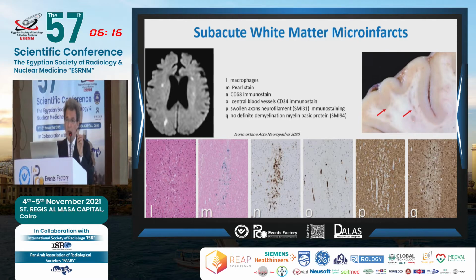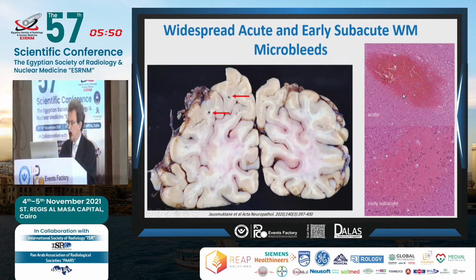Now, you have to be very careful when applying pathological nomenclature to imaging. Quite often you see the term microinfarct being used in the interpretation of MR images. They are not the same. They are talking microinfarct about sub-millimeters. This is not our resolution on MR. So be careful with this language. But what we do see here is microinfarcts on the pathology. And you also see here the multiple microhemorrhages, which were on pathological workup, either acute or early subacute.